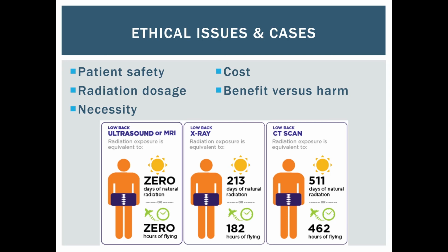And as we can see from the picture, a typical CT scan is much higher in radiation compared to a normal X-ray scan, where a normal lower back CT scan equates to about 511 days of natural radiation.